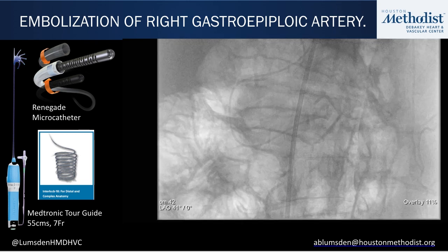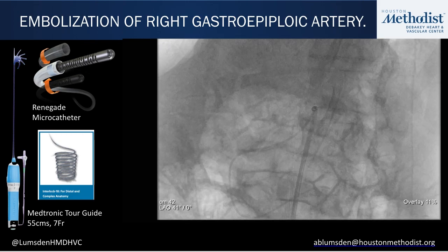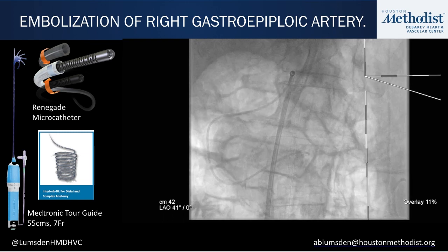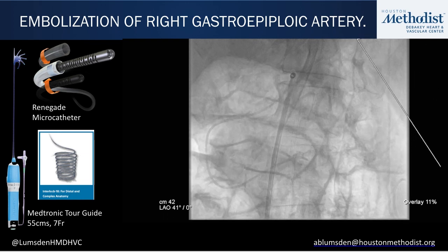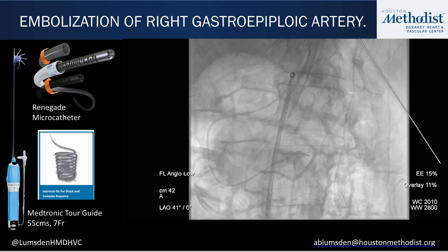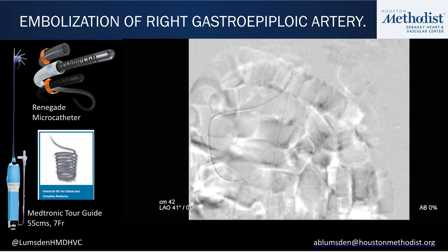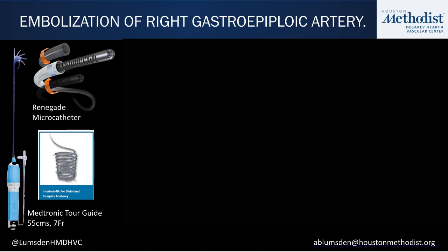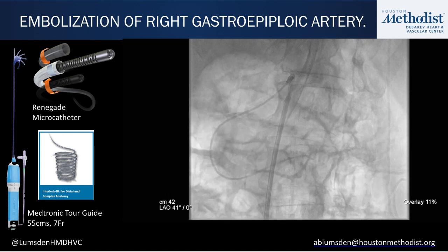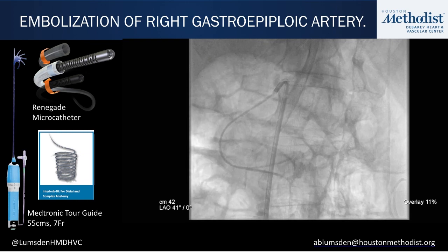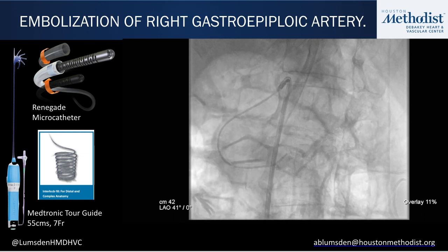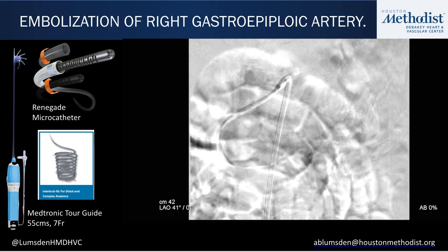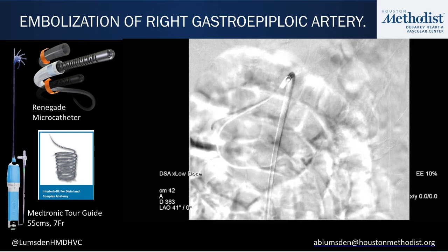At this point we still hadn't identified the source of the bleeding. We reoriented, noting there was a lot of gas in the bowel and the stomach was distended, making visualization difficult. We brought in the collimators to try to even out the radio density of the field. When the wire strayed into side branches we pulled back to get back into the main channel. The technique was to pull back and puff, pull back and puff, until confirmed in the main target artery.